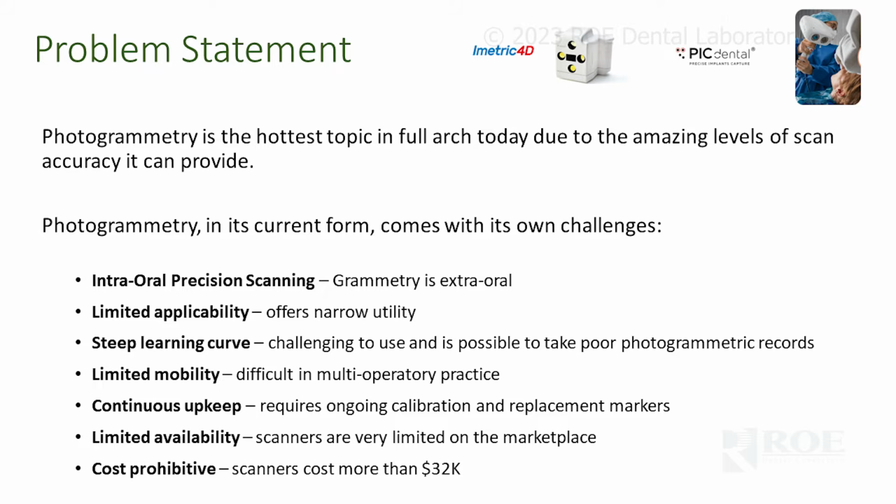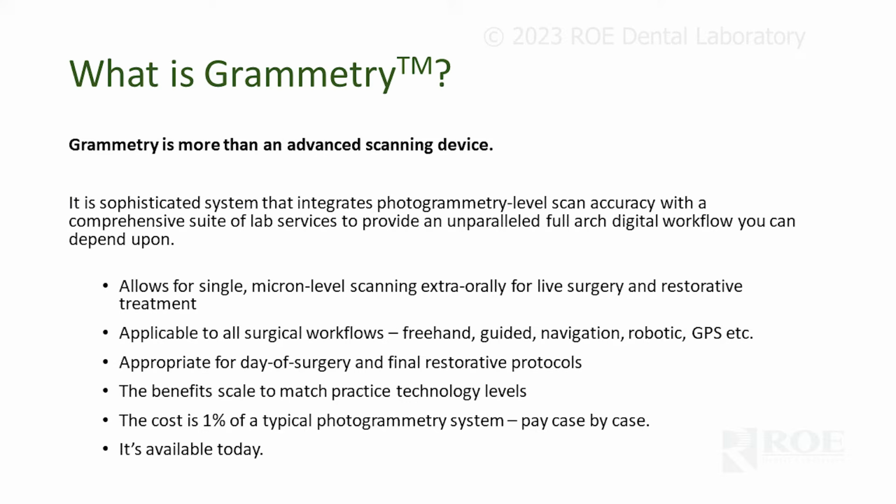It's a bit of a learning curve. The softwares are not terribly simple to use. Again, I don't want to pick on it. The software will catch up, and it'll be a great software, I'm sure, sometime soon. But really, the utility is the difficult part, the challenging part, right? You spend $50,000 on a piece of equipment. It does one thing. It captures a multi-unit abutment position, right? So if you do a lot of these kinds of surgeries, then maybe the utility is there. Maybe it's a good thing to look at.